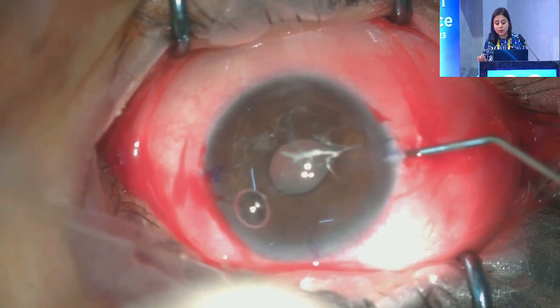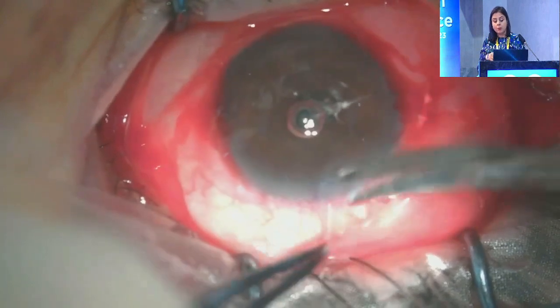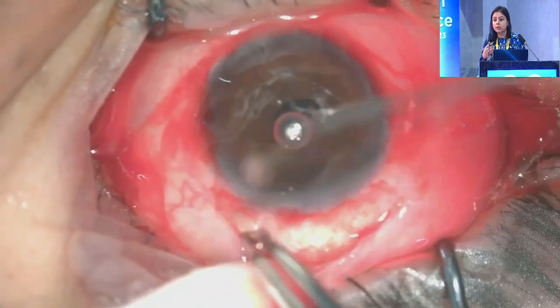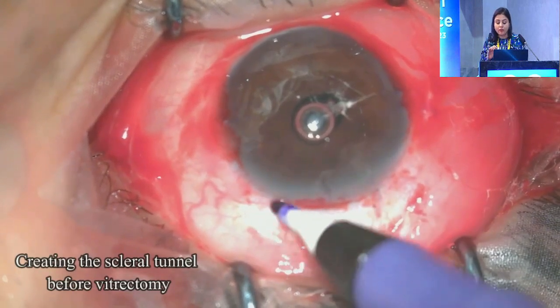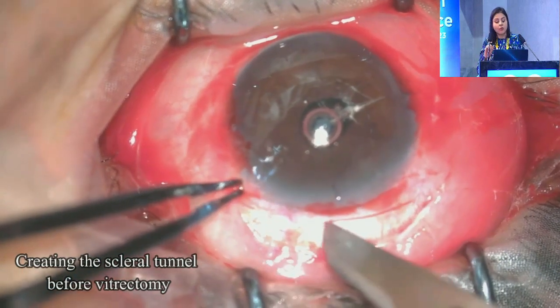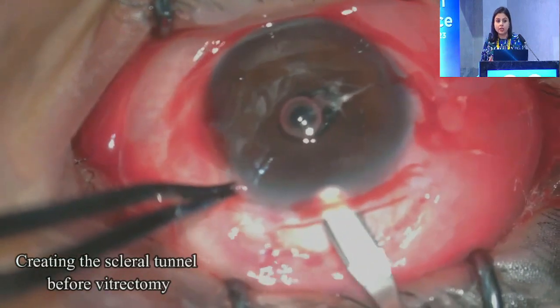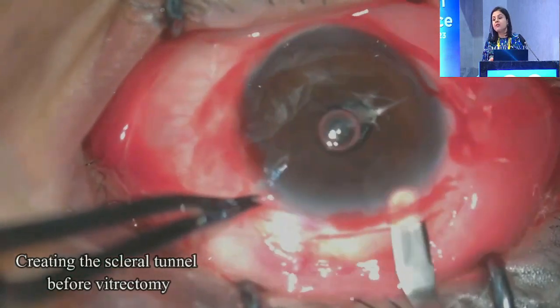And then we are staining the vitreous with the help of diluted triamcinolone. What I like to do is that before I go ahead with the vitrectomy, I create the tunnel, because after we vitrectomize the eye can become soft and it can be a little tricky to create the tunnel. We typically need about a 5.5 millimeter scleral tunnel, because the optic of this IOL is 5.4 millimeters. Initially I am just using the crescent knife, but I am not entering the anterior chamber yet. We are going to keep the tunnel and then perform the vitrectomy so that we have a stable chamber.